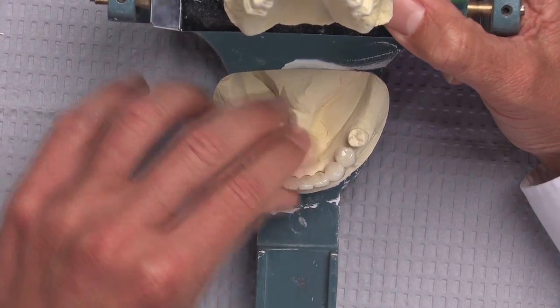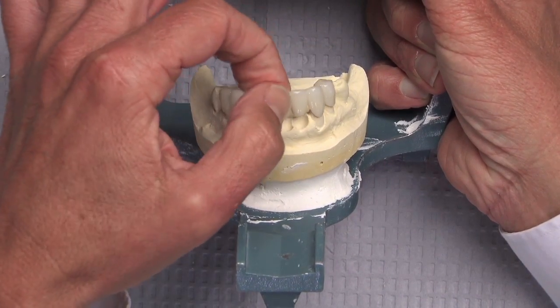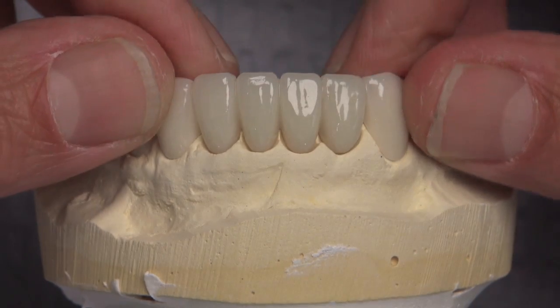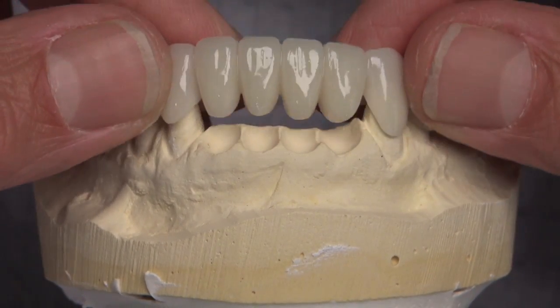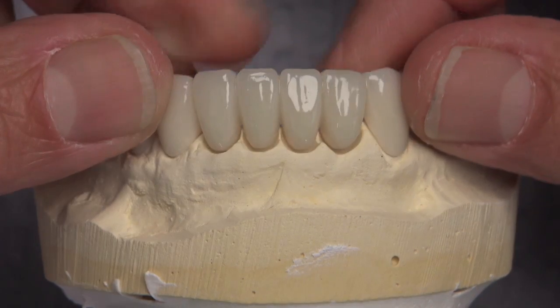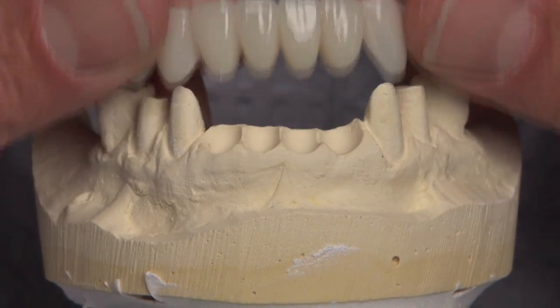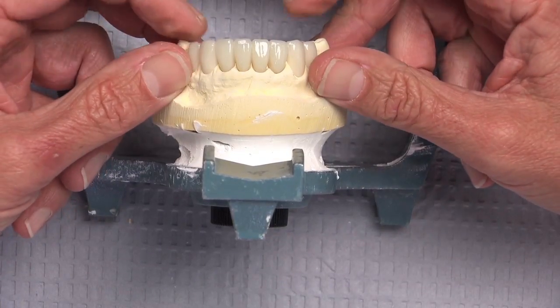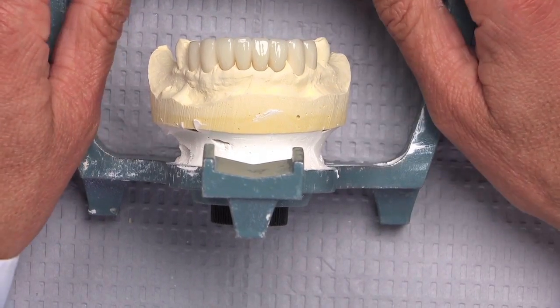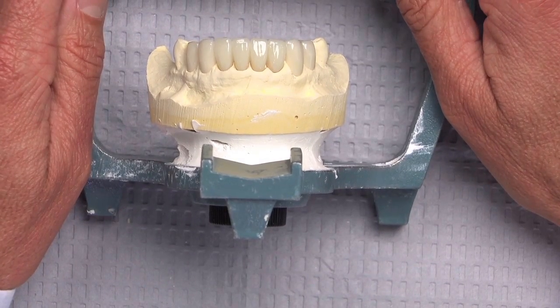All this dentist has to do is extract these four anterior teeth, prep the two abutments, and then reline this bio temp bridge. You can see that ovate pontic portion on the bio temp just slipping into those extraction sites. This is just the easiest way to take advantage of doing a same-day extraction — such an easy way to really create a natural looking emergence profile where it'll look like the pontics on this bridge are literally growing right out of the tissue. Obviously it's not as important on lower anteriors as it is on upper anteriors, but you might as well have it look good. So bio temps — one of the great indications for me is to use them on the date of extraction to create beautiful ovate pontic receptor sites.